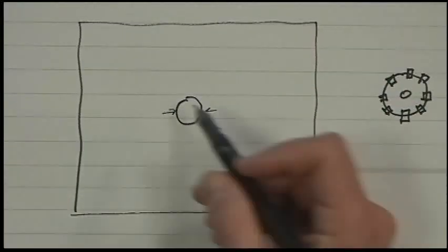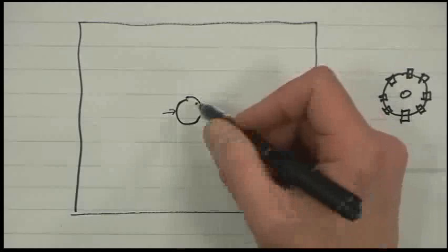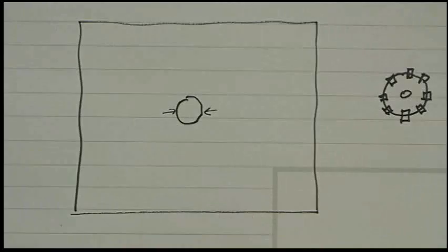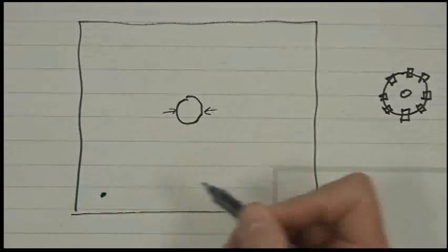So anyway, you can just think of it as a one-dimensional car that travels back and forth like regular cars, okay? And you have an accelerator pedal. The voltage is like the accelerator pedal, and you're driving, okay? So let's say you want to drive around with the accelerator. Let's say you start here, and you want to go up here.